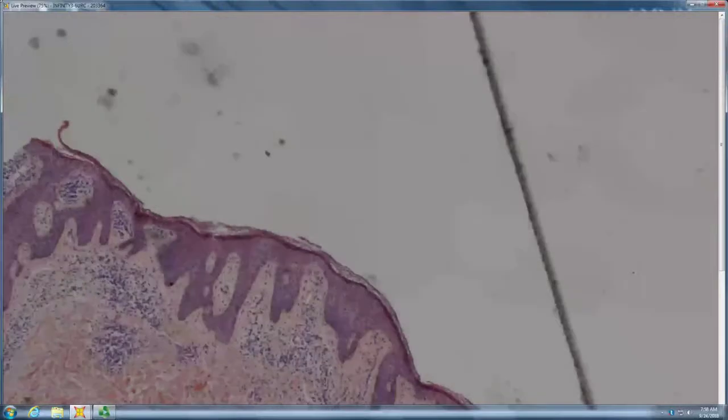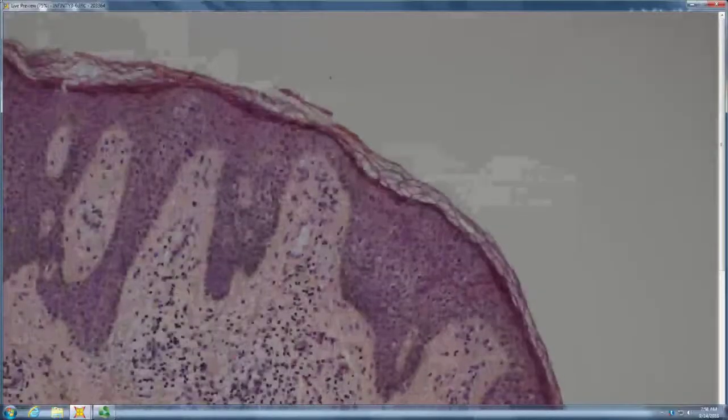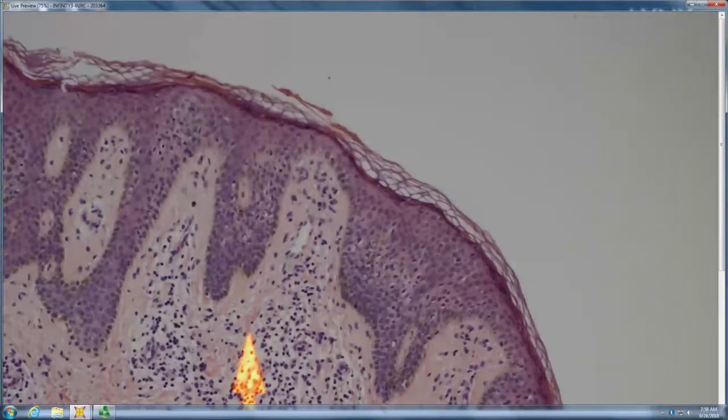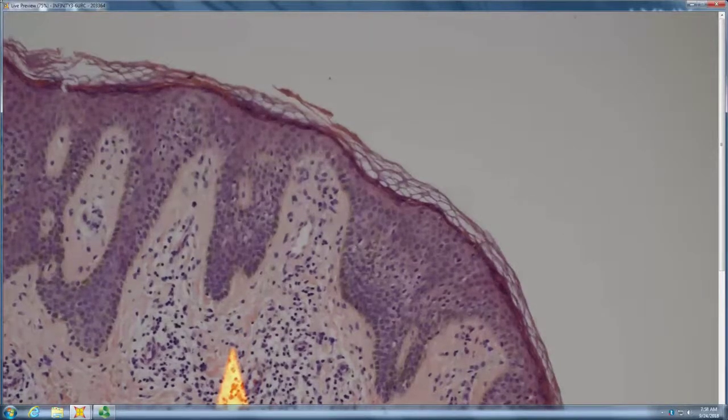So punch biopsy, some lichenoid infiltrate. So punch biopsy, band-like infiltrate, or exocytosis. Tell me about the collagen. Light pink, like linguine, like collagen maybe. Yeah, you've got ropey collagen in your papillary dermis, right? So that counts as papillodermal fibrosis. That makes you wonder about MF.